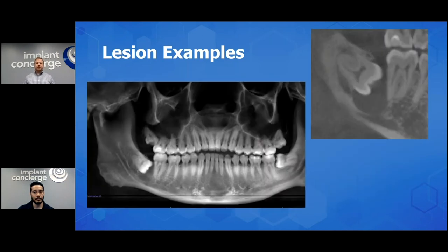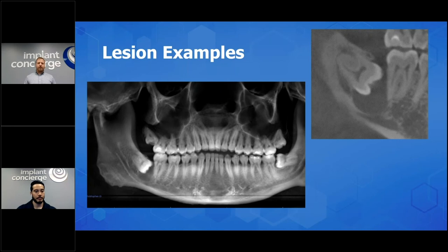This next case: low density. And this one is pretty much a slam dunk because there's one finding that makes it very clear. When this lesion was first described 100 years ago, that description has not changed. Whether it's a periapical, a panoramic, or a cone beam CT — what do we see? That low density, corticated area surrounding the crown, going from the cementoenamel junction to cementoenamel junction.